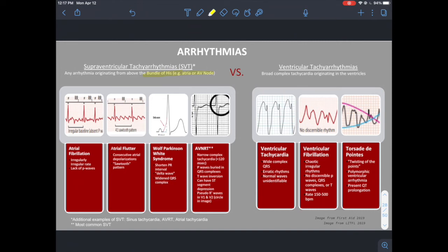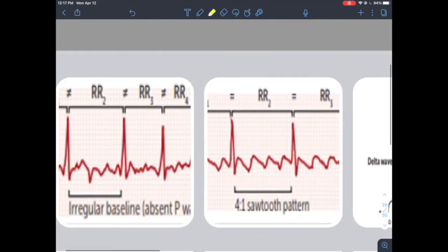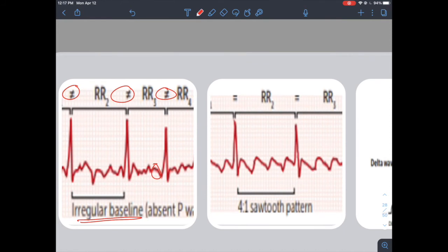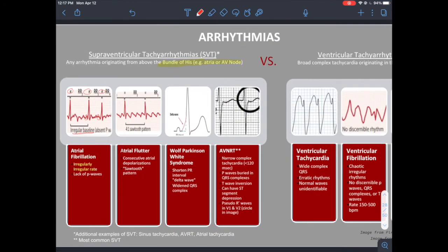Atrial fibrillation: the buzzword is irregularly irregular. The RR distances are not equal and have no pattern. Additionally, you don't see P waves consistently — there may be missing P waves or an unclear baseline. The irregular baseline is a classic feature of AFib. This comes from the pathophysiology of chaotic atrial electrical activity.